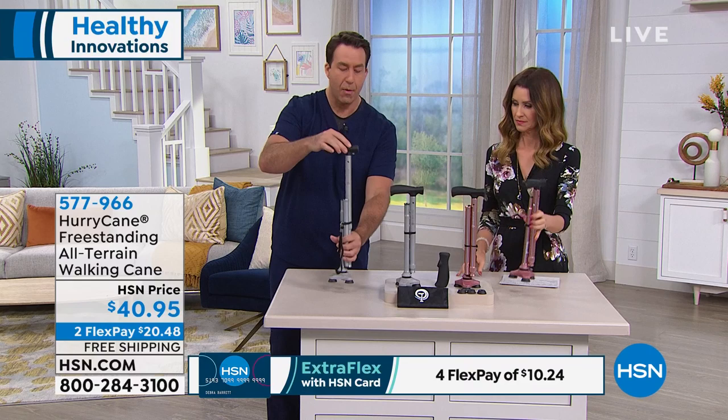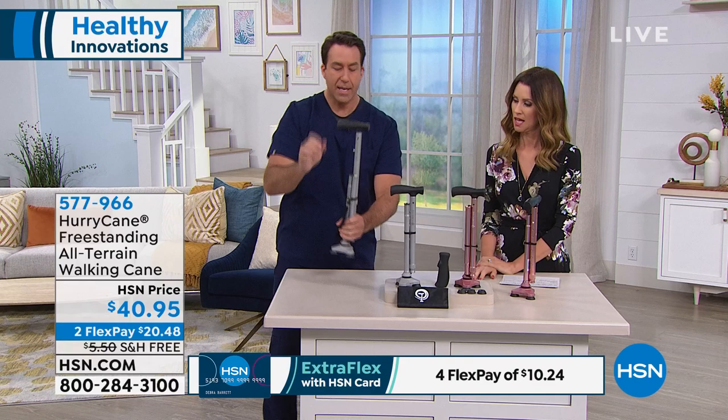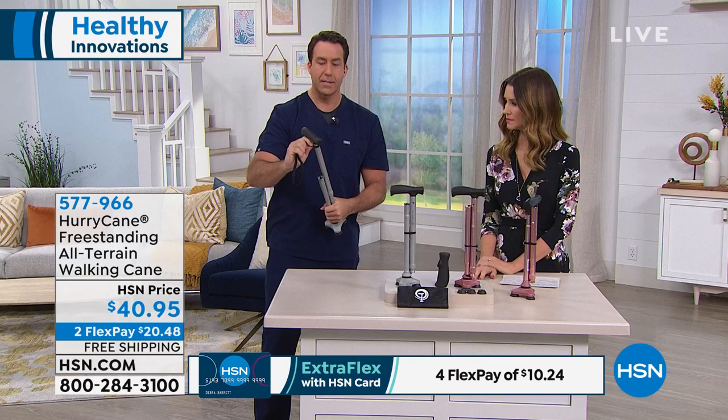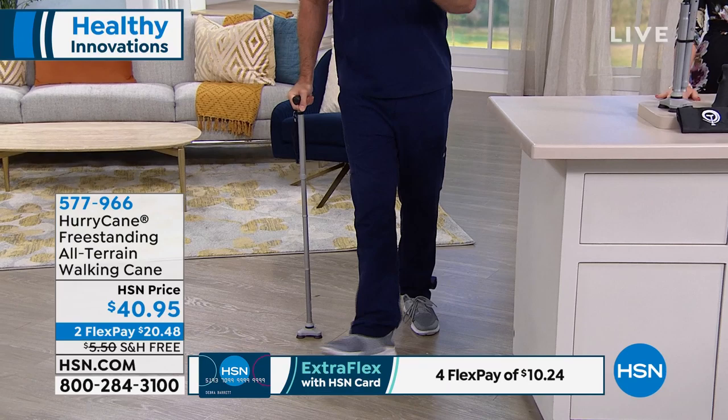Eight height adjustments — I have a Hurricane here that is on the appropriate height setting for me. It collapses all the way down to just over a foot. You have a safety strap here, so you can use this while you're walking, and you can also use it to fold up your Hurricane when you don't want it to unfold. I'm going to remove that safety strap and look how easy it is to start with my Hurricane — it puts itself together.